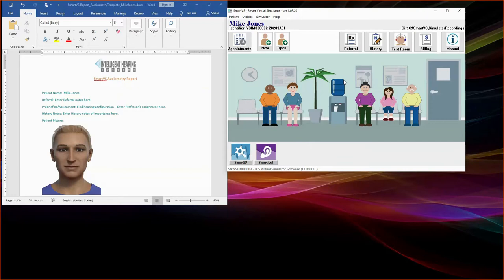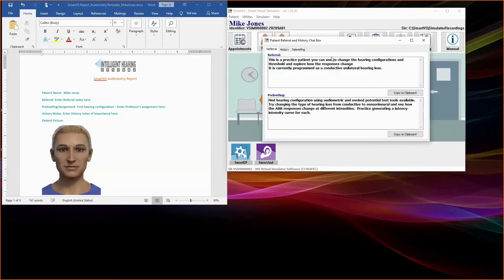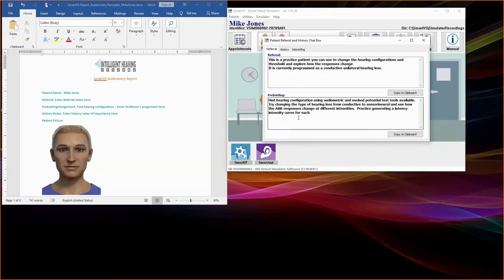Before starting examination, click on the Referral button to review the referral note. Here you will find out why the patient was referred for testing. And in the pre-briefing section, you will be able to assess what the professor is requesting of this assignment. Please note, your professor may give you verbal or written instructions that may be different from the pre-briefing notes listed on the electronic copy of the profile. Please adhere to your instructor's assignment.